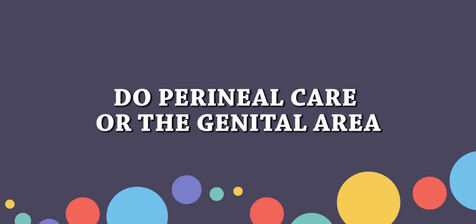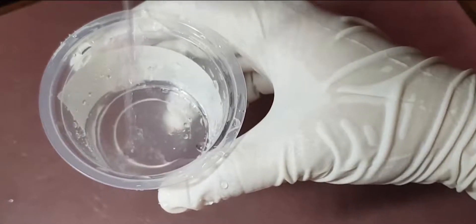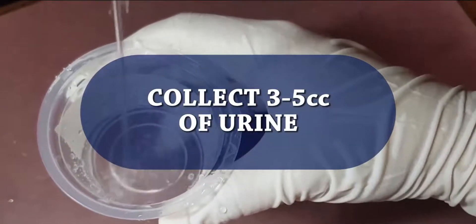And don't forget to do the perineal care to ensure the genital is clean. Then, start collecting the urine. Do not collect the first stream of urine, as it may be contaminated. Make sure to collect the midstream urine for about 3 to 5 cc.